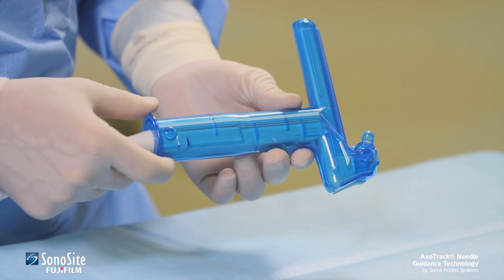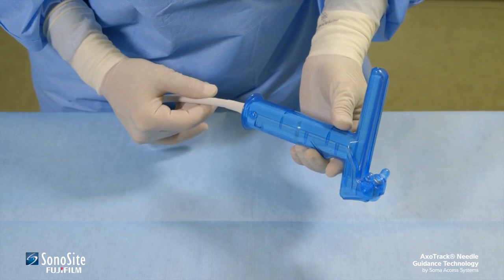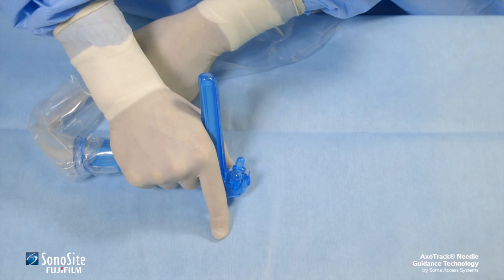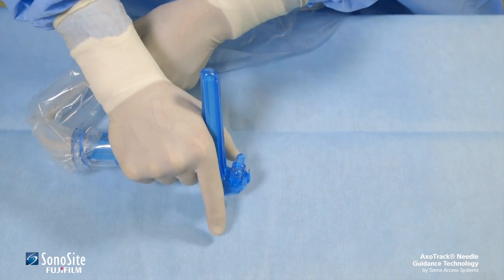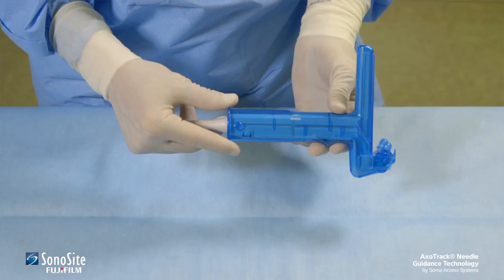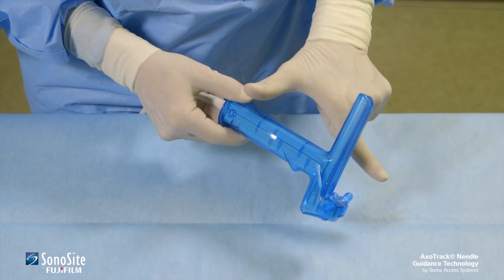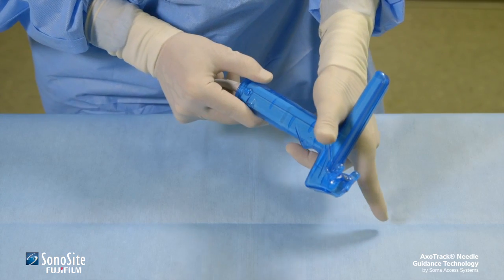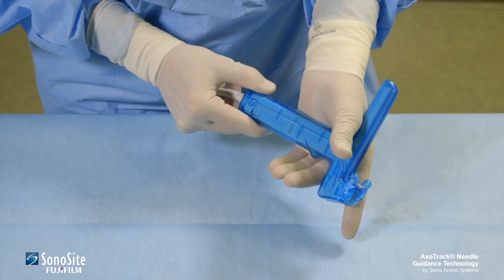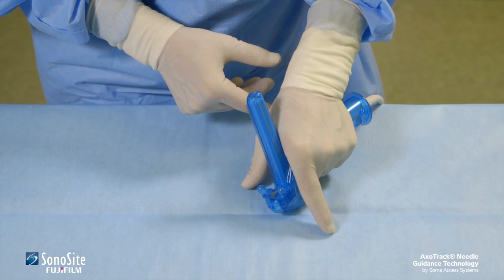The Sonosight AxoTrack equipped transducer has a unique design that allows it to be held securely, facilitating accurate needle guidance. Once assembled with the transducer shield, the transducer can be held in either hand. For optimal stability during use, make an L with the thumb and forefinger and place it up against the vertical post. Grip the transducer with the middle finger in front of the finger guide. This leaves the thumb and forefinger free to act as stabilizers on the patient.